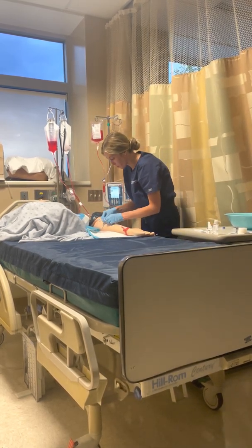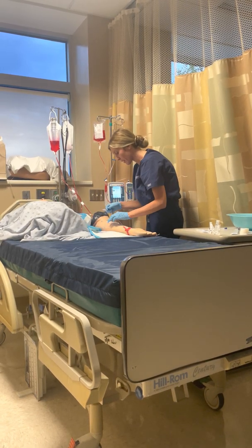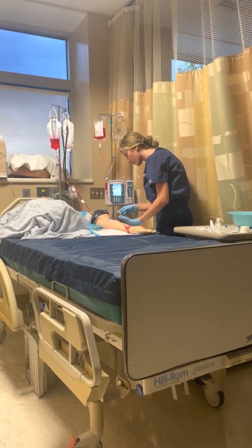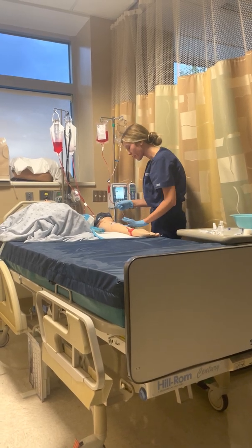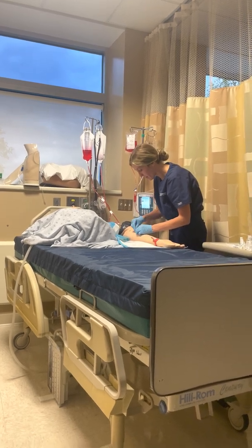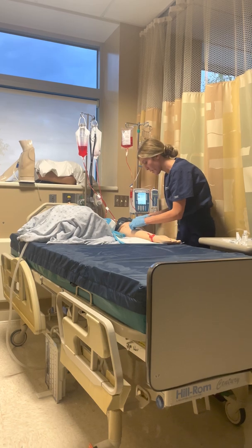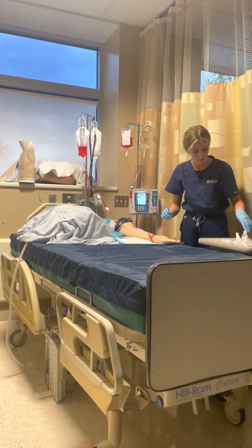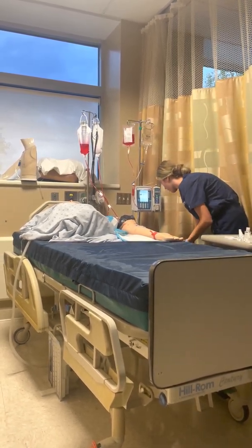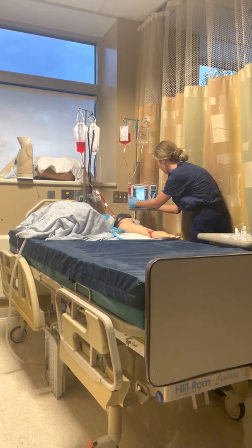And then we will start getting you hooked up. And the IV site looks good. There's no masses, swelling, bruises. Does it feel tender at all? It does not. Okay, good. So then we'll put this in, and I'll unlock the roller clamp, and then we'll start the infusion, okay? Are you comfortable, Betty? I am very comfortable. Thank you. Okay, good. All right, so we're going to make sure this is unlocked, and then I'll hit start here.